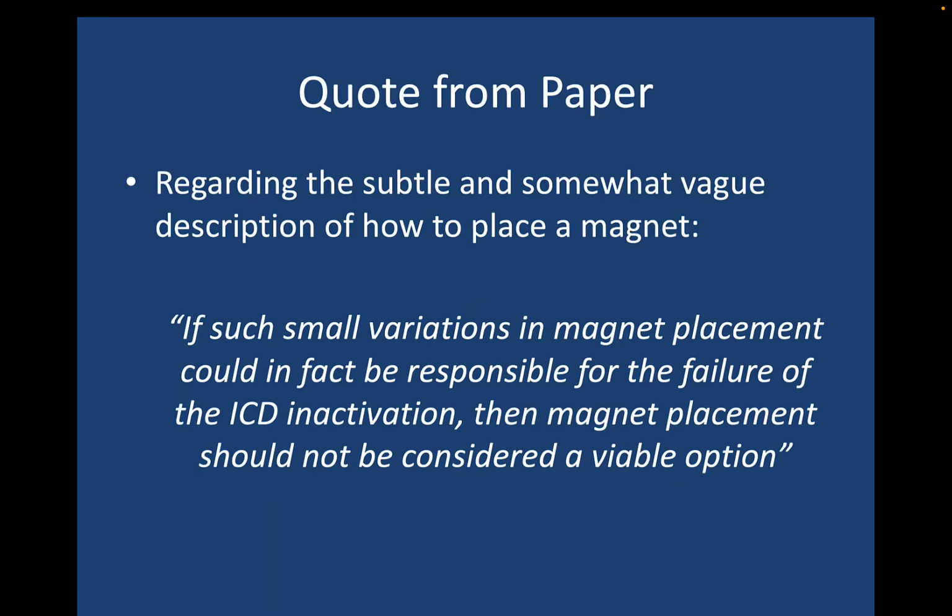Now, interesting, a quote from that second paper, regarding the subtle and somewhat vague description of how to place a magnet. It says if such small variations of magnet placement could in fact be responsible for the failure of the ICD inactivation, then magnet placement should not be considered a viable option. Now, I pretty much agree with this comment.